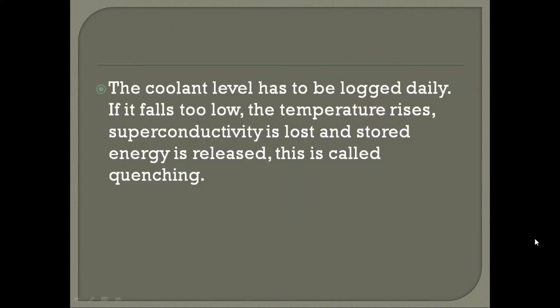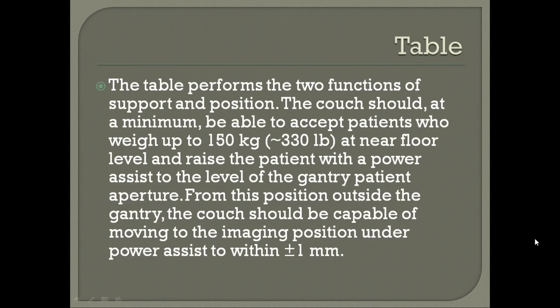The coolant level has to be logged daily. If it falls too low, the temperature will rise, superconductivity will be lost, and stored energy will be released. This phenomenon is known as quenching. Now we come to the table.